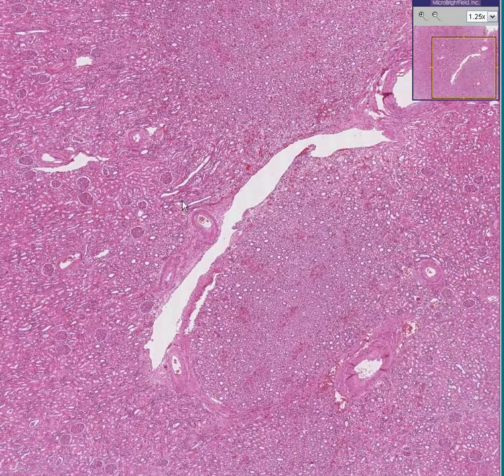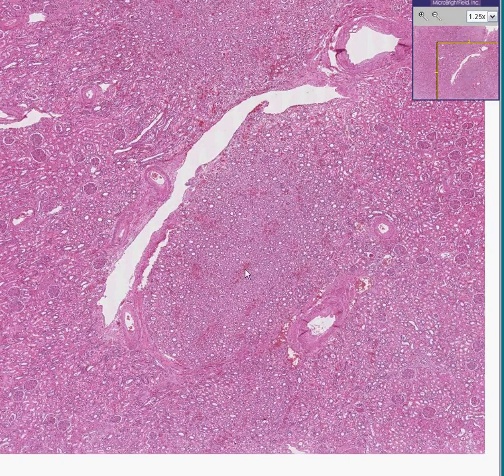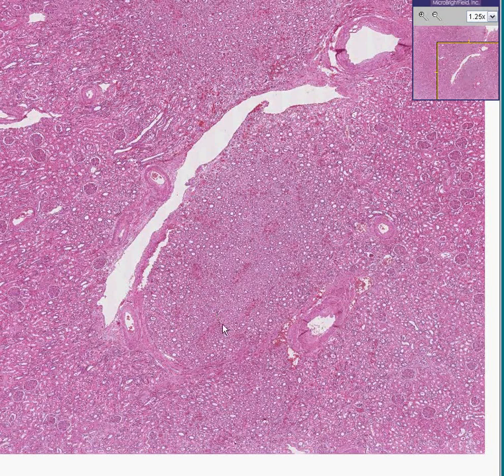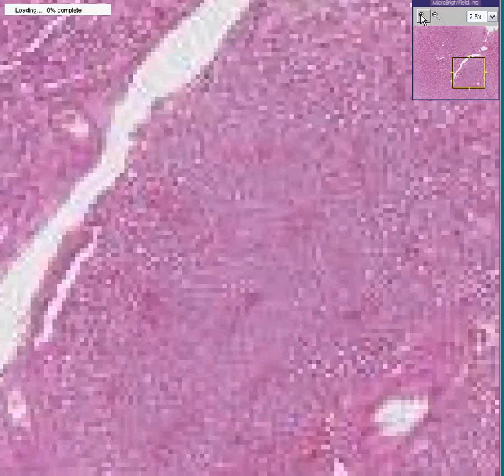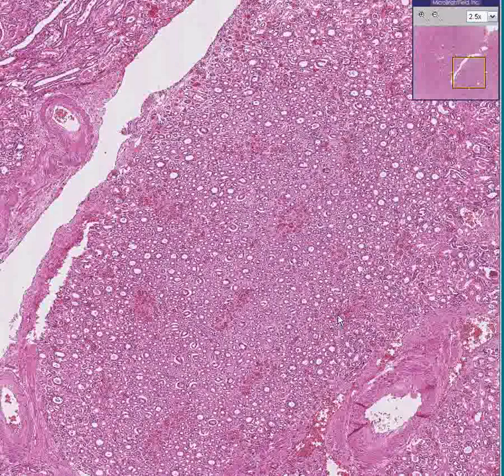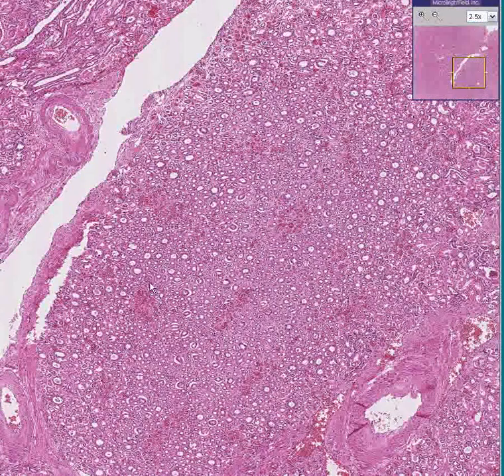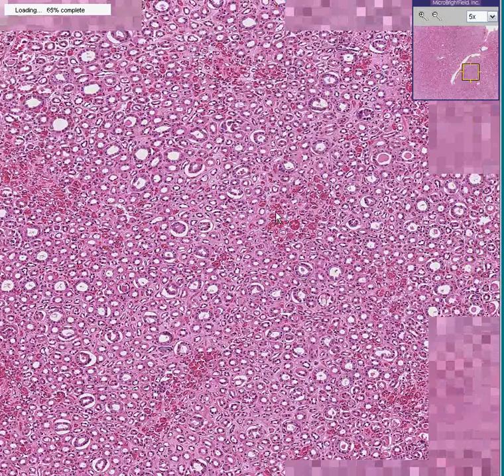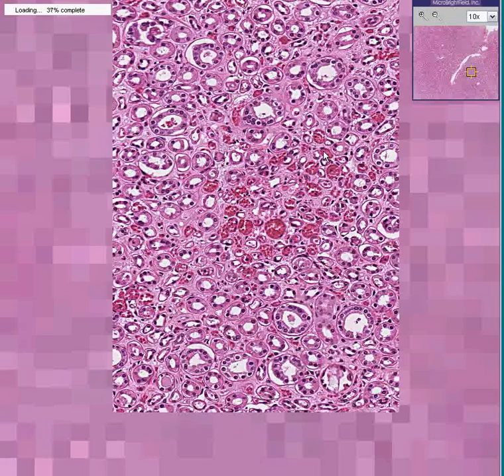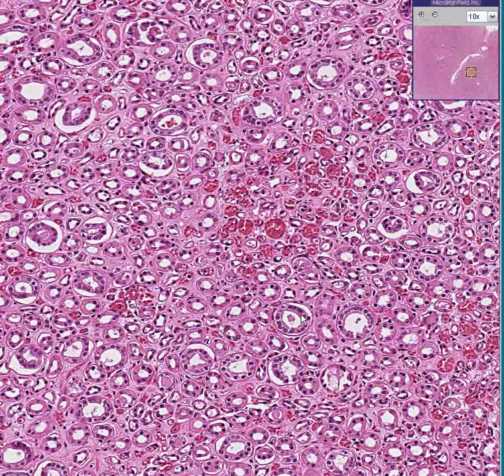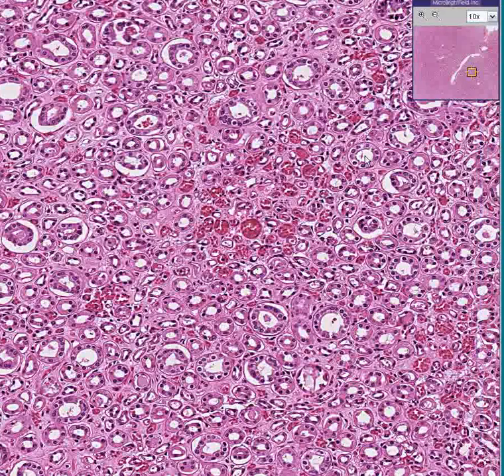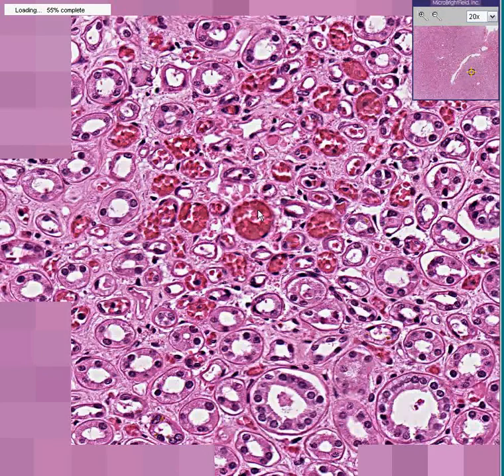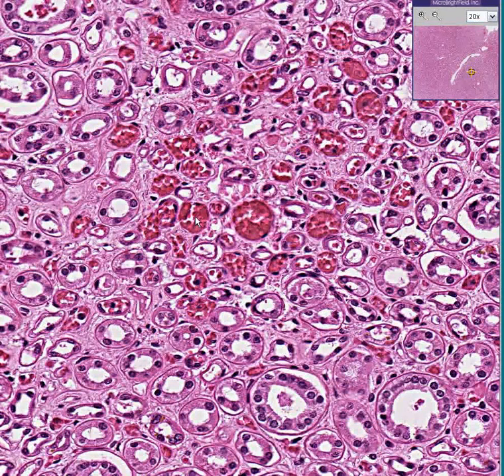The first thing that might hit your eye is that within the area which is predominantly tubular — perhaps inside of the medulla, deep within a pyramid — you see little irregular areas. And when you look closely at these areas, relative to the normal surrounding tubules, the first thing you notice is that they may be tubules but you can't really make out their cytoplasm and nuclei very well. These are necrotic tubules.